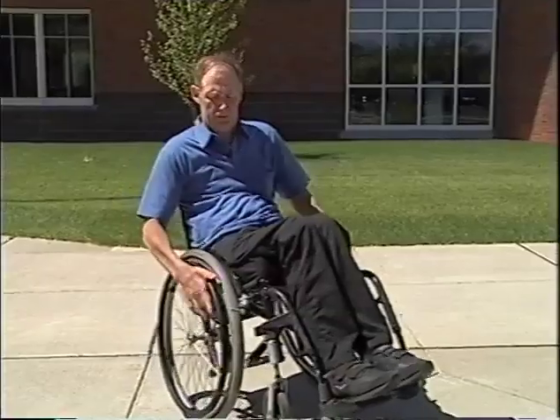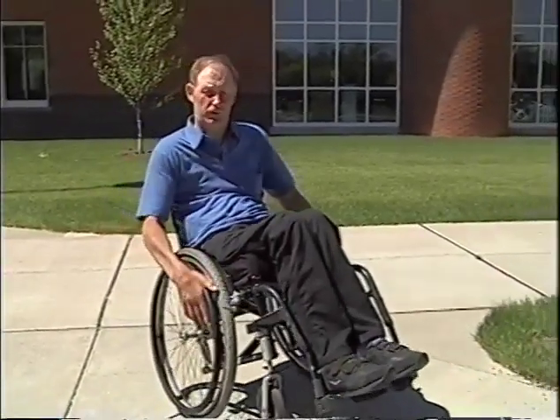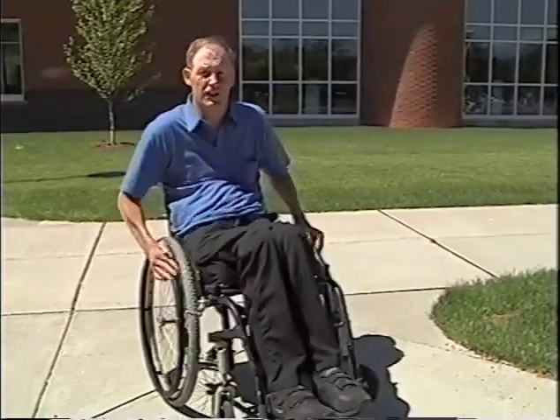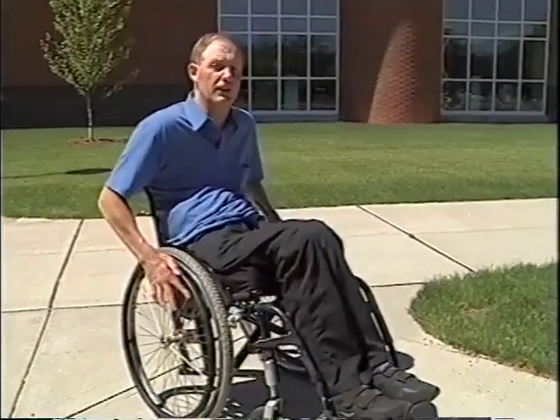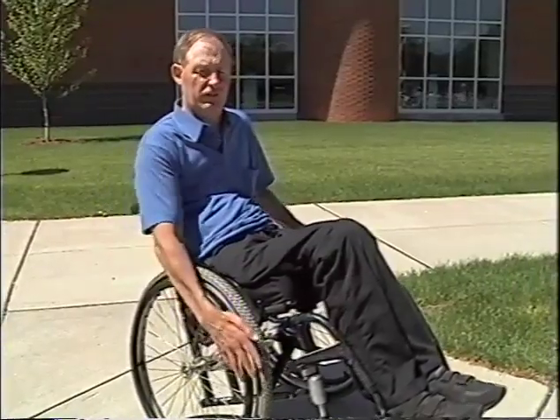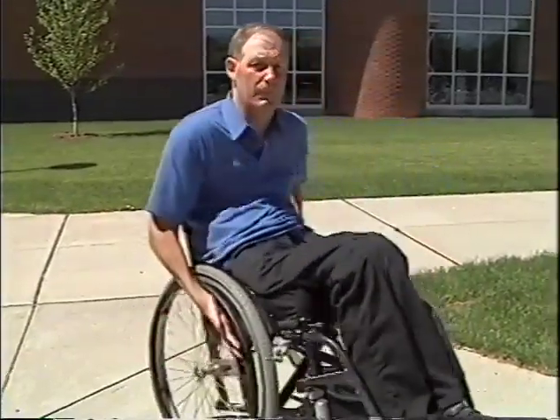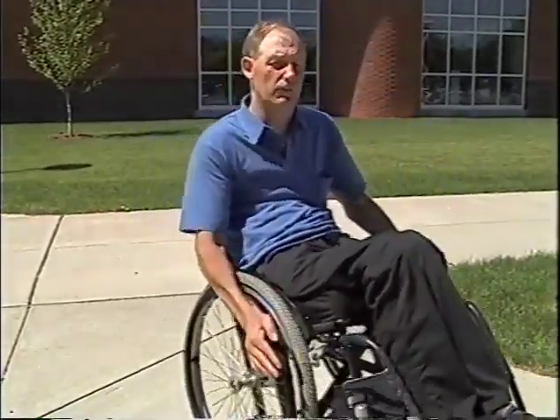When you're teaching wheelies, if you have a patient or if you're a student of wheelies and you're learning this stuff, if you get into this herky-jerky type of motion, generally it's because you're taking your hands off of the chair, and as soon as you do that, you lose control. So what you need to learn is just sliding your hands on the hand rims, and when you do that, you can be in control of the chair all of the time. You're never out of control.